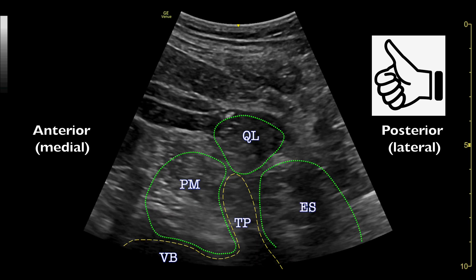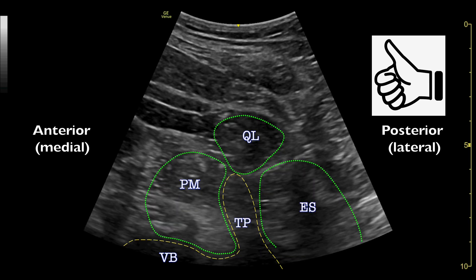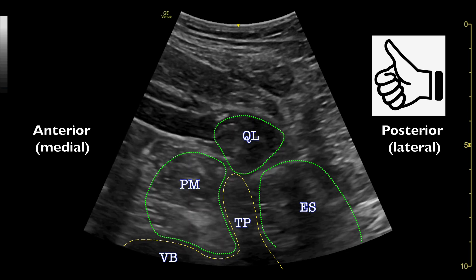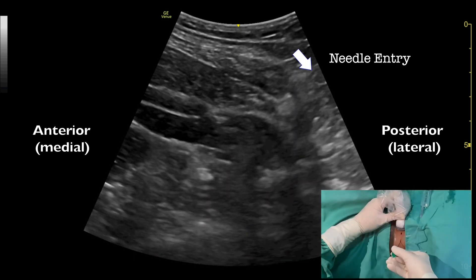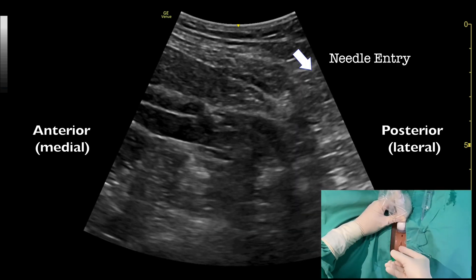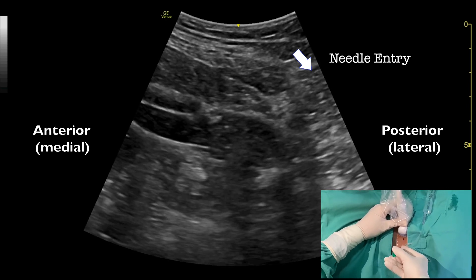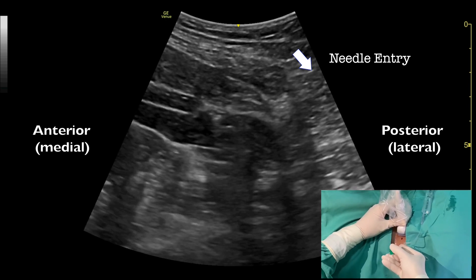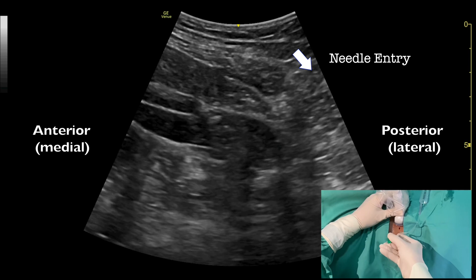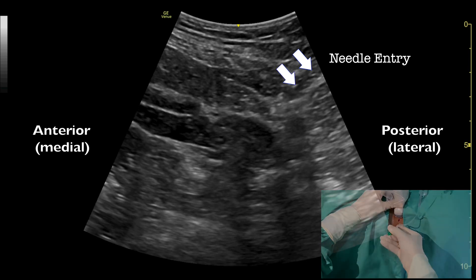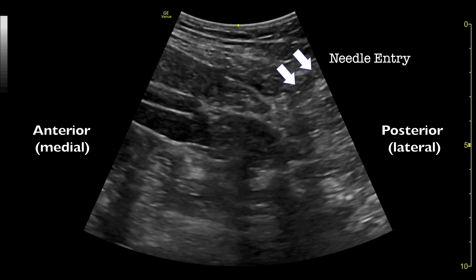The depth of the image usually needs to be increased to get this view. An 80mm block needle is inserted in-plane from the posterior end of the transducer. The needle will go through the quadratus lumborum muscle.